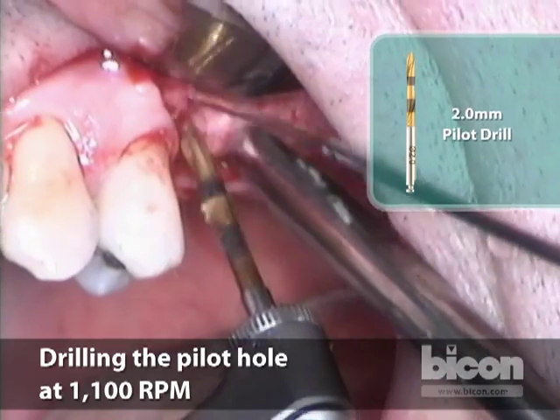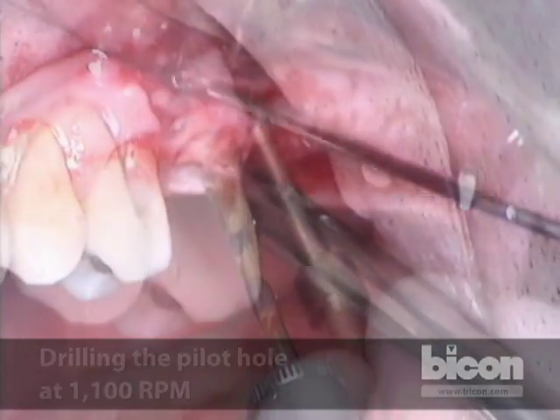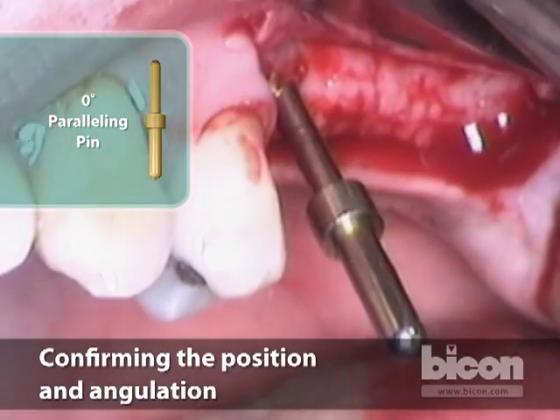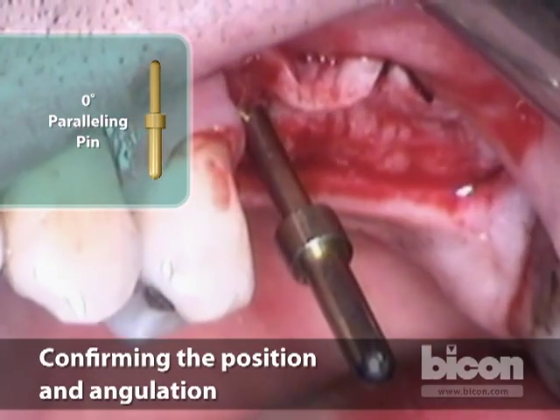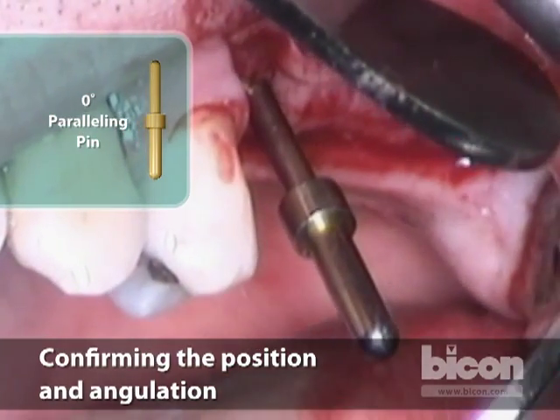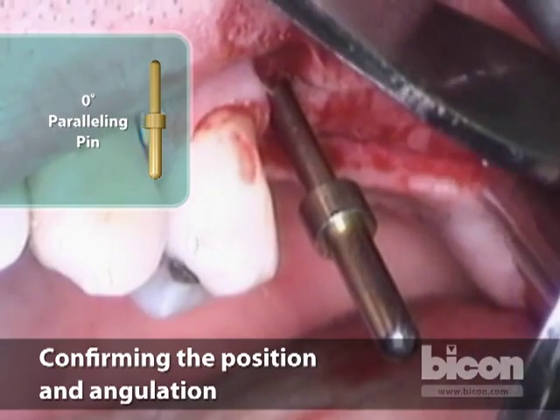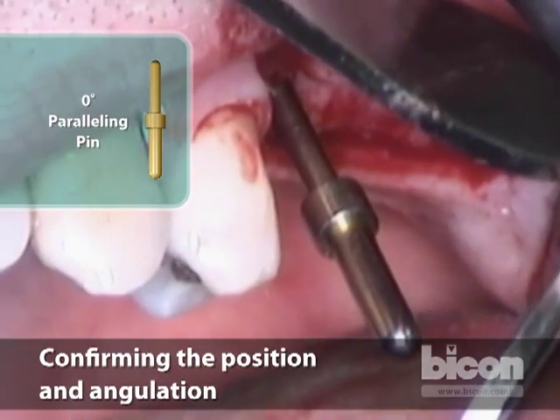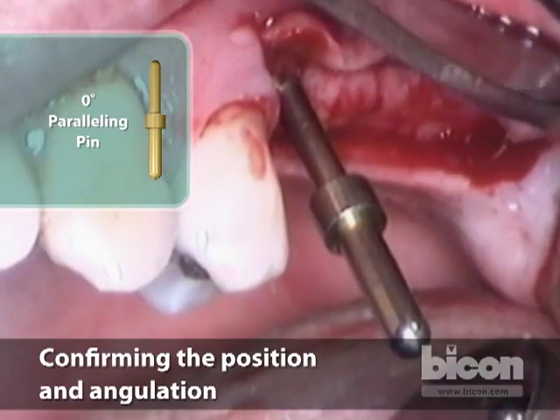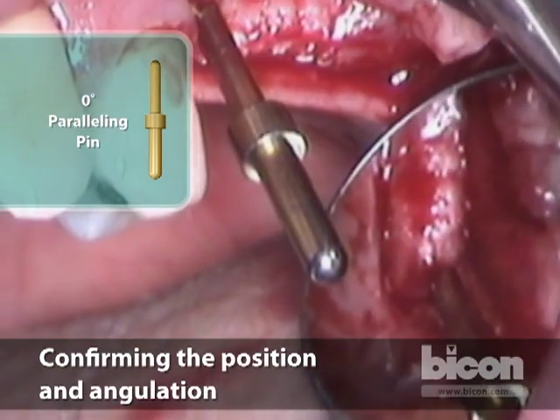Using a high-speed with a sharp pilot drill, we will create our pilot hole — at least the beginning of it. We take a paralleling pin to check that from an occlusal standpoint the osteotomy is started in the right proximity. It appears it might be slightly distal, so I would like to move the osteotomy slightly mesially and slightly palatally, as the edge of our buccal extent of the bone is a little bit too close for comfort.